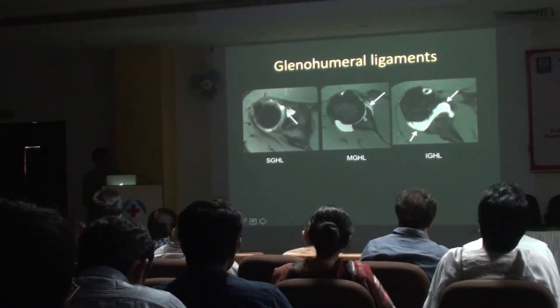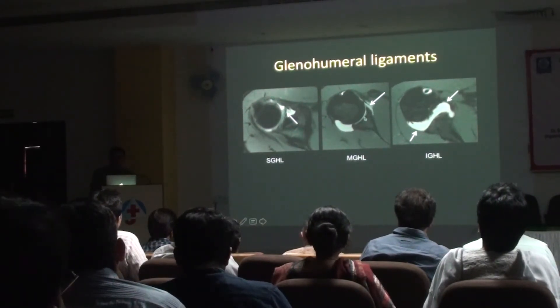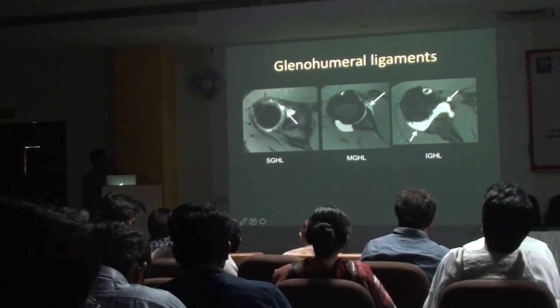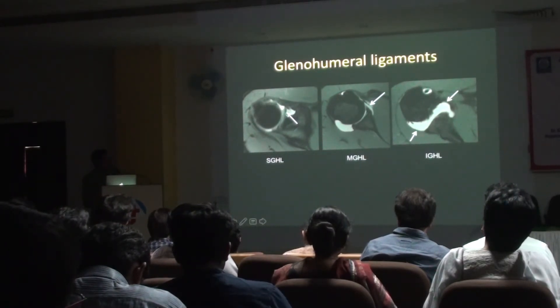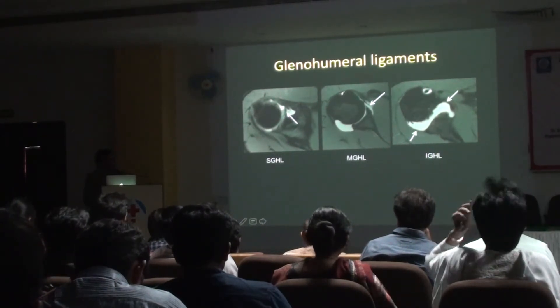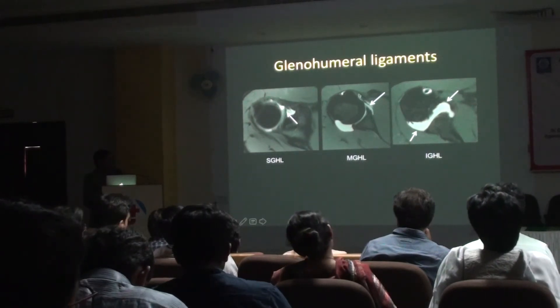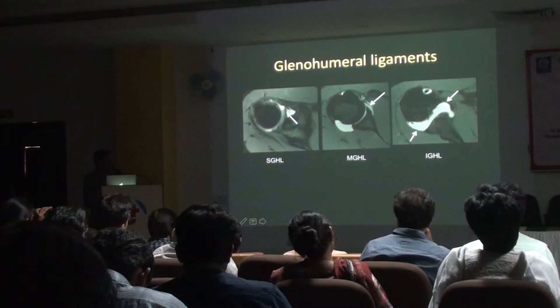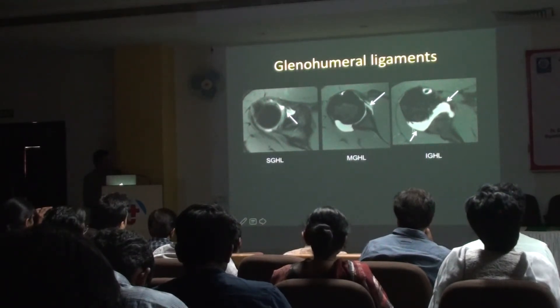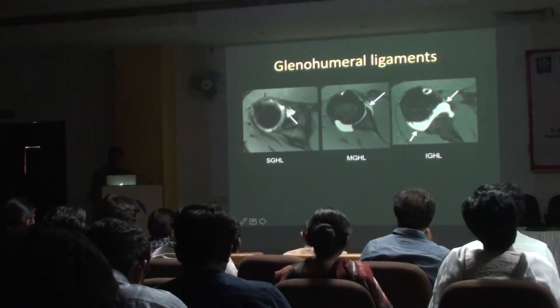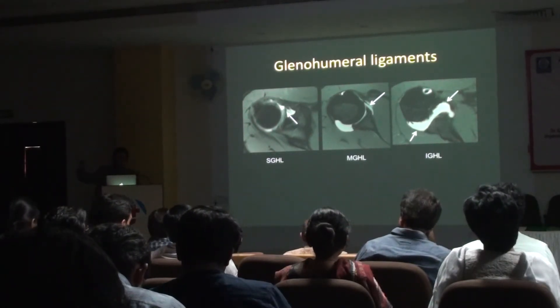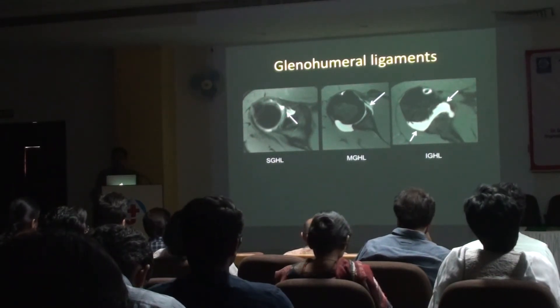The glenohumeral ligaments are beautifully appreciated on arthrogram — you might struggle to see them on non-arthrographic images. Look at the coracoid process: whatever structure parallels the coracoid process is your SGHL (superior glenohumeral ligament). Anything paralleling the subscapularis is your MGHL (middle glenohumeral ligament). And inferiorly, you have the posterior band and anterior band of the IGHL (inferior glenohumeral ligament).